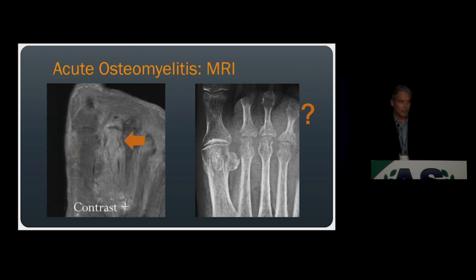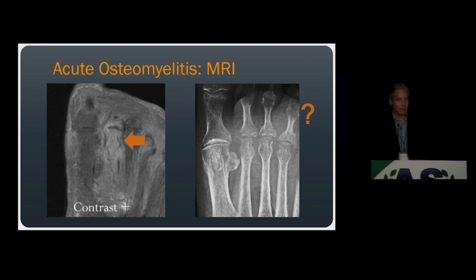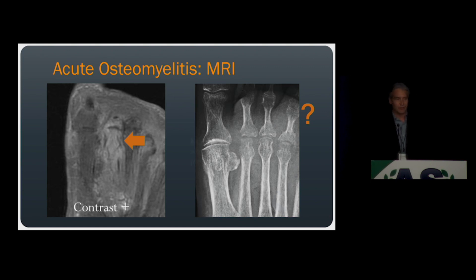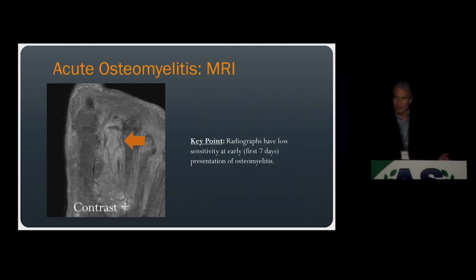This is where MRI can be very useful. On post-contrast imaging of the same patient, we see exuberant enhancement in the second metatarsal head, consistent with osteomyelitis. This brings the first key point: radiographs have very low sensitivity for diagnosing osteomyelitis at early presentation.